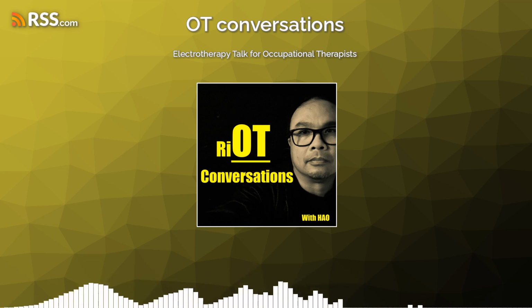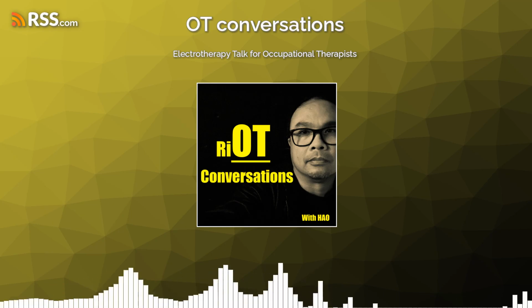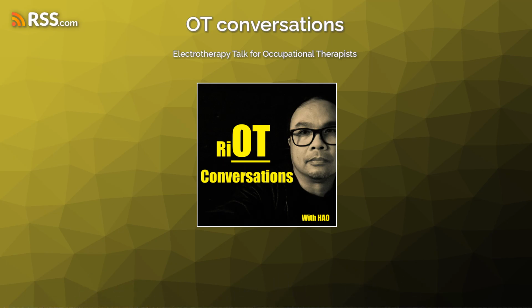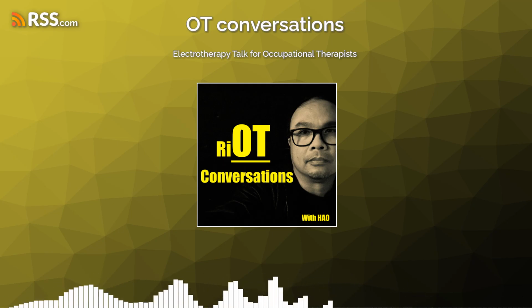Functional electrical stimulation, or FES. Yes, this is something that I've used. It stimulates the muscle to perform functional tasks such as grasping or walking, particularly for those with neurological impairments, commonly used in stroke rehabilitation, spinal cord injury, functional use.